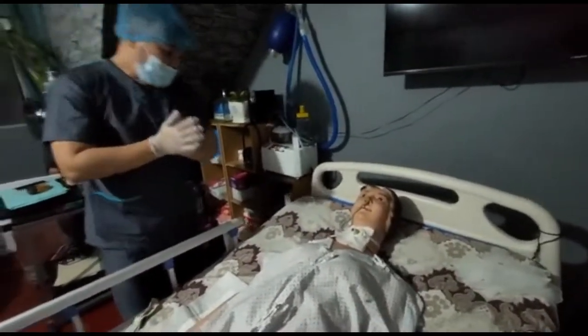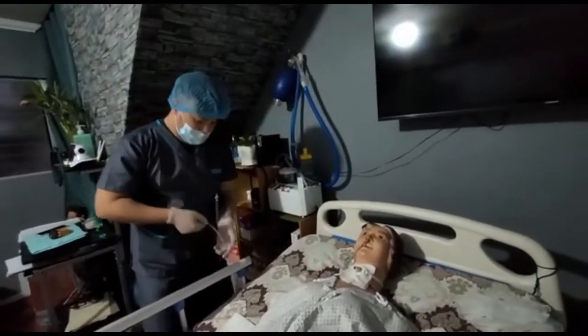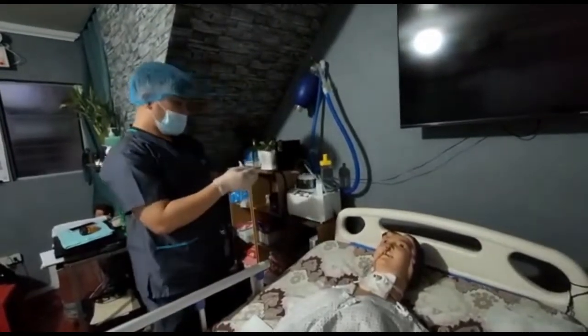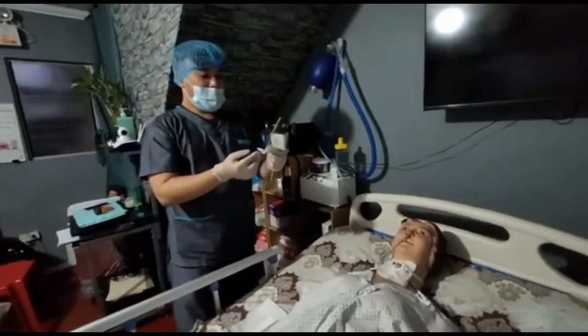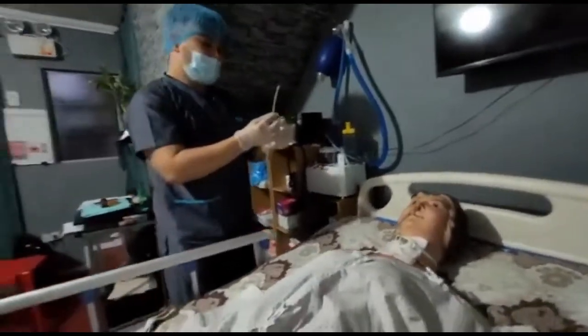Suction. And now we can proceed sa suctioning. So make sure na meron tayong 4 to 5 inches para sa pag-suction.